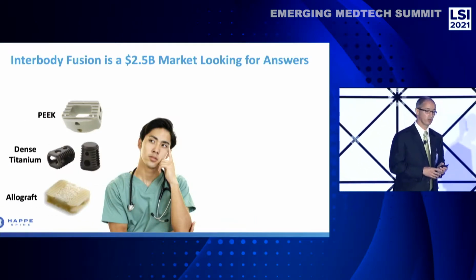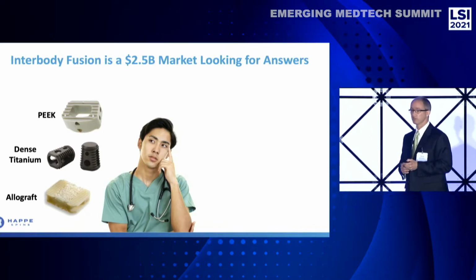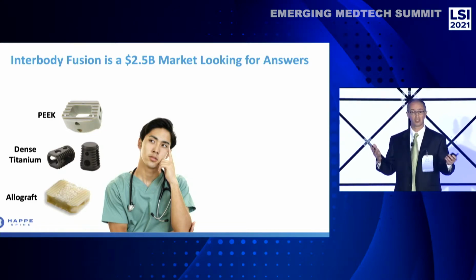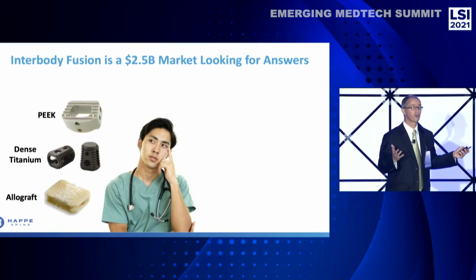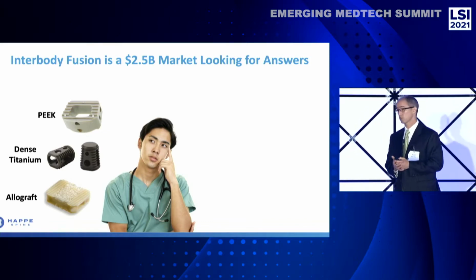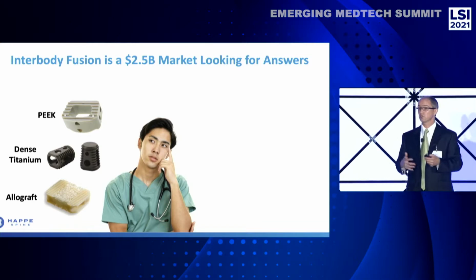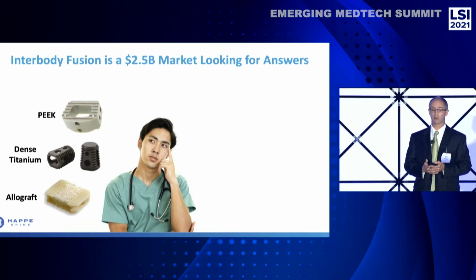And I can explain why here with a brief history. Up until about 10 years ago, there were 3 options in interbody spinal fusion. There was allograft, which is kind of the long-standing option, right? It's bone. It performs very well biologically. It still is the gold standard today in many ways in terms of the biologic performance. But then titanium came over, borrowed from orthopedics. And then titanium became quickly displaced by PEEK, and the reason was because titanium inhibits post-op radiographic imaging, and it suffers from subsidence due to its rigidity. And so PEEK solved these issues, at least at that time, and became the market leader up until a time of about a decade ago.